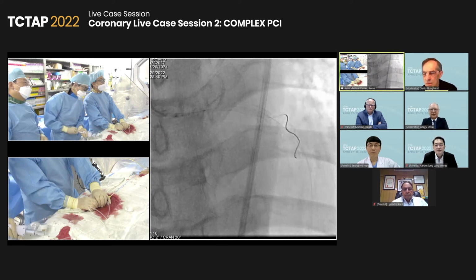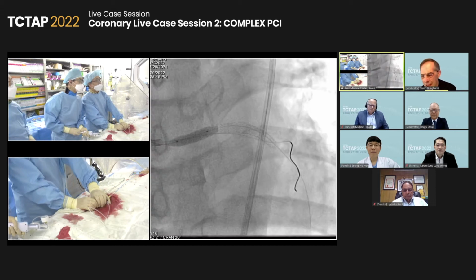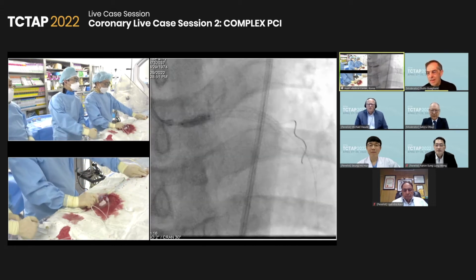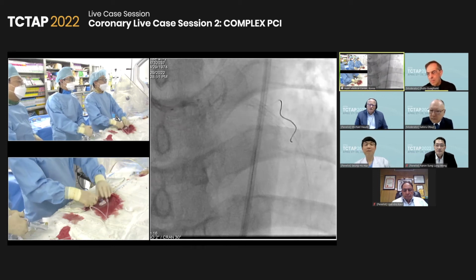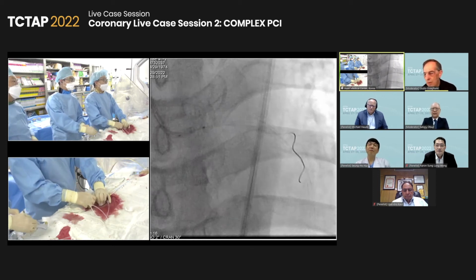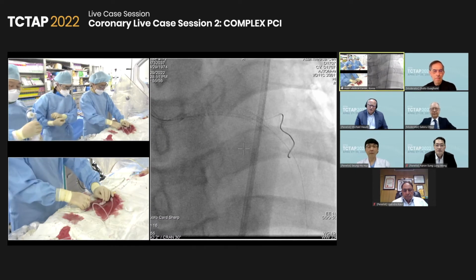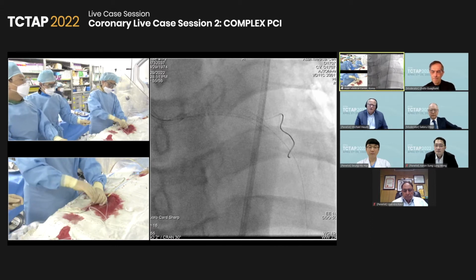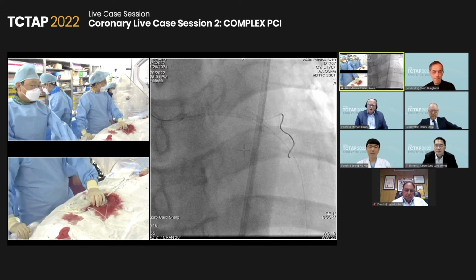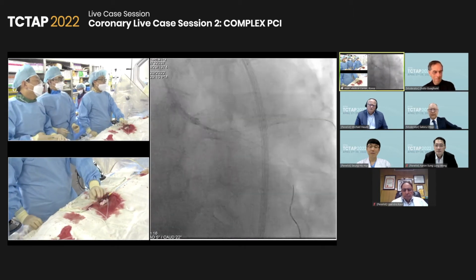So the vast majority of the panelists agree that it is possibly better to do post dilation at the ostium, to avoid the slippage and the deformation of the stent. Going ahead, our strategy is very straightforward. We put one long stent on the basis of the IVUS finding. We will check the coronary angio over here again.